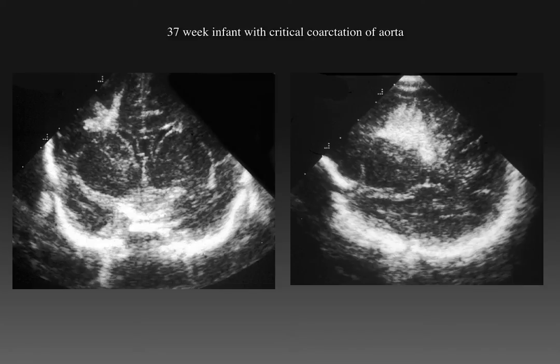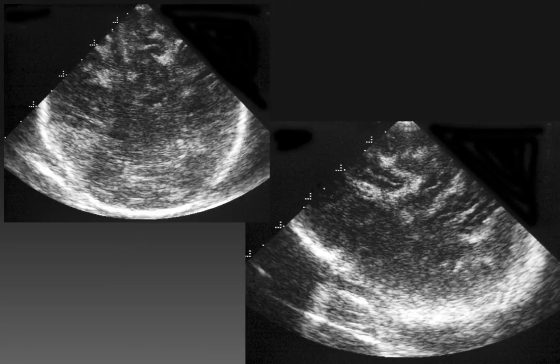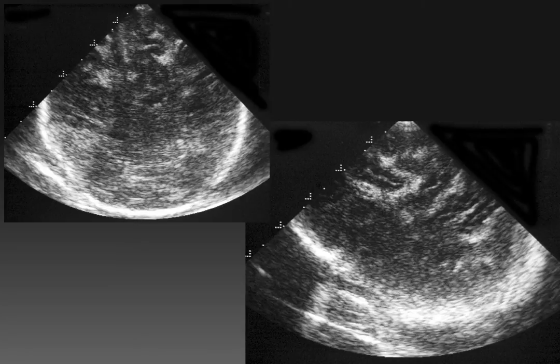In another child who is near-term with critical coarctation of the aorta, we see a flame-shaped hypertensive hemorrhage in the deep white matter. Now, this patient has had diffuse hypoxic ischemic injury, is full-term, and we can see these focal bright bands of increased echogenicity surrounding the gyri in the central portions of the brain. These represent secondary hemorrhage in the subcortical U-fibers. Secondary hemorrhage can be seen as brightly echogenic lesions that occur not as a result of a clotting abnormality, but as a result of underlying abnormal brain.